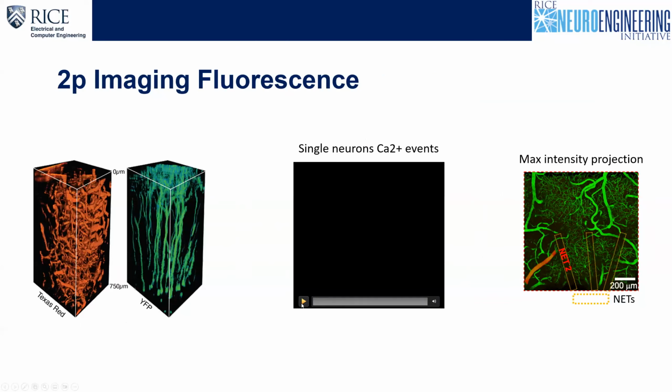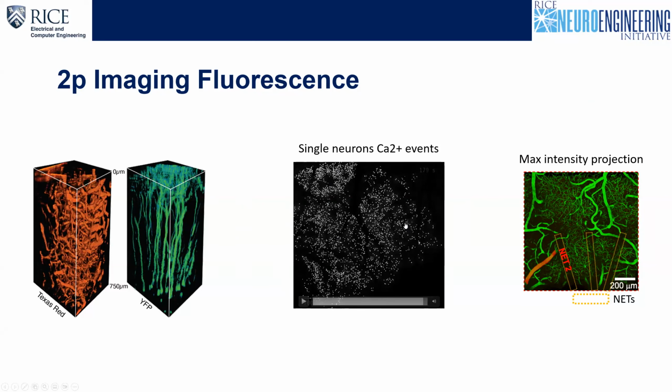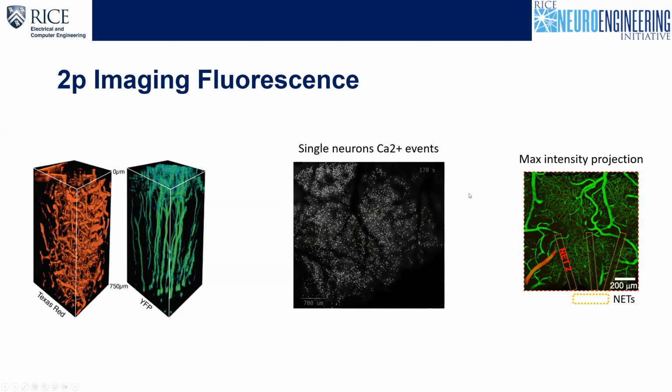What I mean by imaging is that we can do fluorescence imaging, and we can see single neurons firing in the brain. Here is a video showing single neurons firing in the brain. If you notice these very small, tiny spots, they're flickering. This flickering is a single neuron. These are individual neurons that are firing in the brain. And then at the end, it highlights all of these points where our processing algorithm found the neurons in these spatial locations. I'll just play it one more time. All of this flickering is single neurons which might be communicating with each other, or processing some information in the brain.